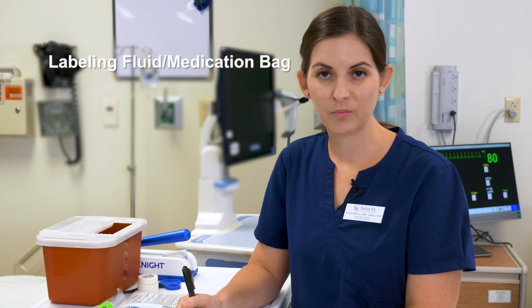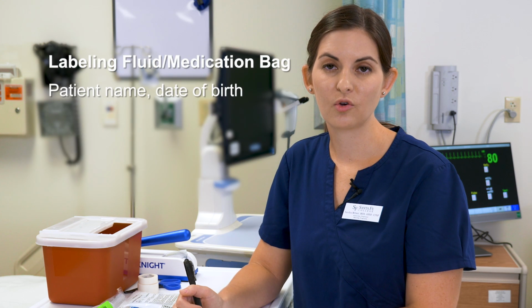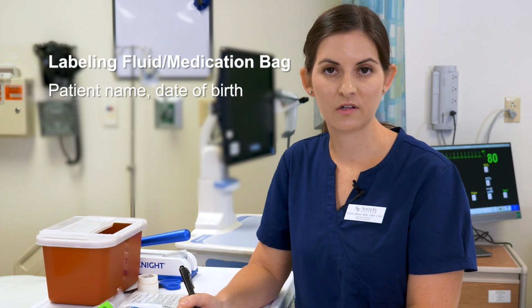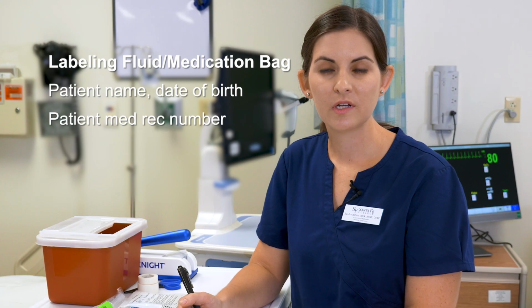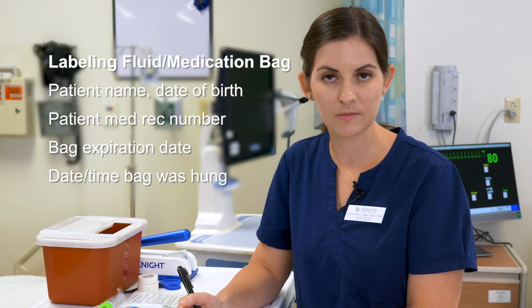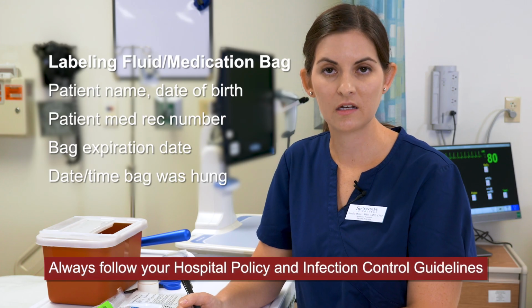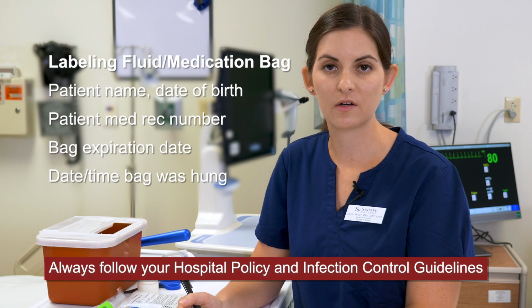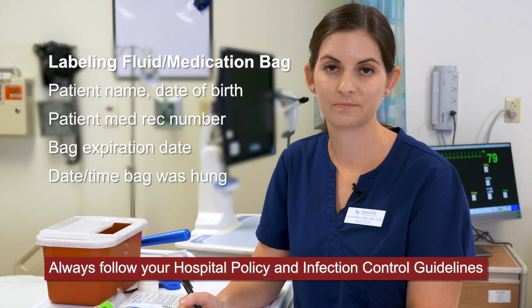When labeling your fluid bag or your medication bag, you always want to make sure that your patient's name and date of birth is on the bag, and their MedRec number is on the bag. You also want to include when the bag will expire. So what date and time did you hang the IV bag, and what date does it expire? Again, the expiration is going to vary depending on the most recent infection control policies.